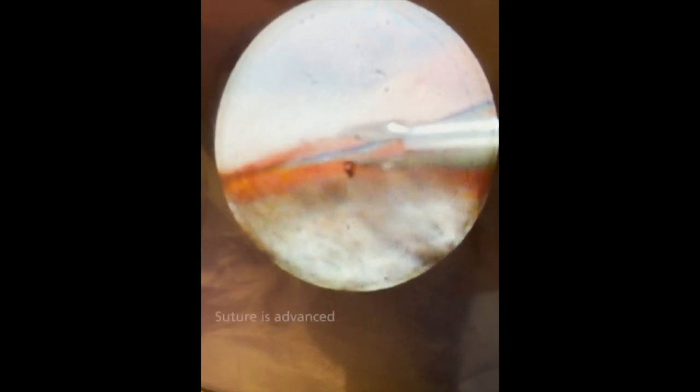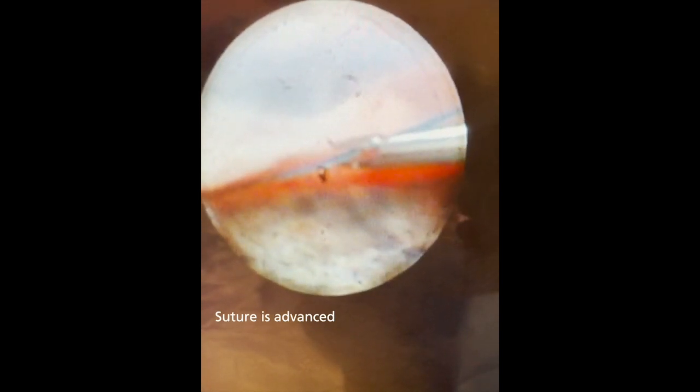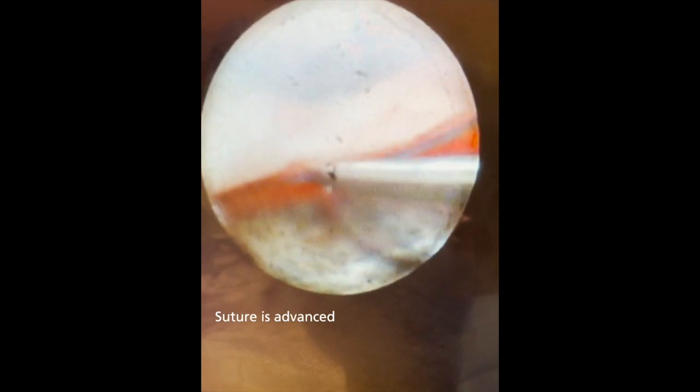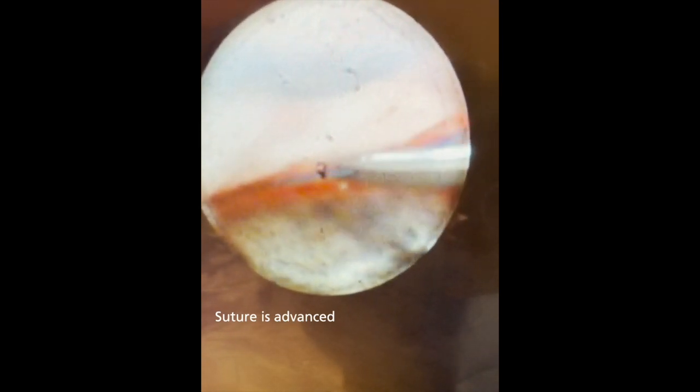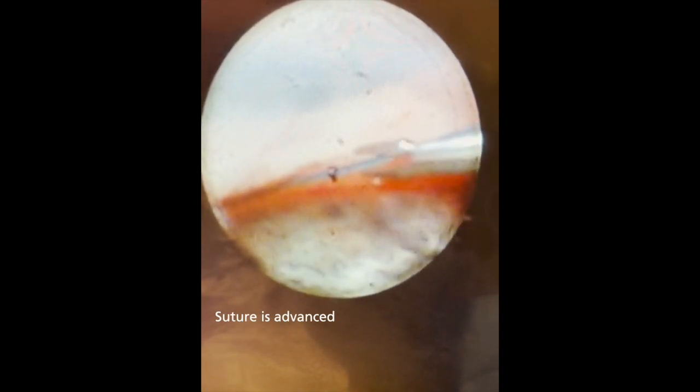And after we'd confirmed this placement, we went ahead and continued to feed the suture. And this does take some experience where there's a little bit of a tactile feedback that we're able to feel while feeding this suture. If all of a sudden we lose that tactile feedback, particularly if the patient has pain, there's a chance that we've entered the suprachoroidal space.